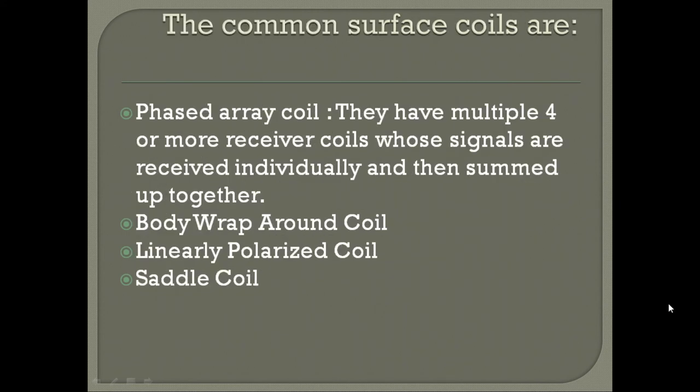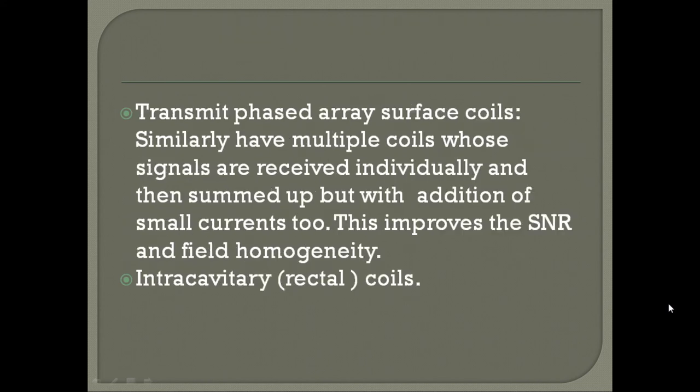The common surface coils are phased array coil, body wraparound coil, linearly polarized coil, saddle coil, transmit phased array surface coil, or intracavitary coil.